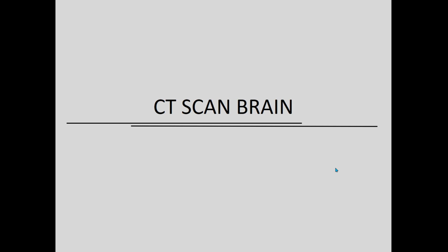So whenever we ask you about the name of the investigation, along with writing down CT scan brain, you must mention that this is without contrast. I'm telling you this for your syllabus, because there may be CT with contrast or without contrast, but since we have included only the CT scan brain for trauma, and in trauma we do CT scan without contrast.